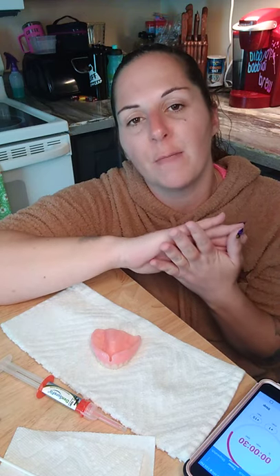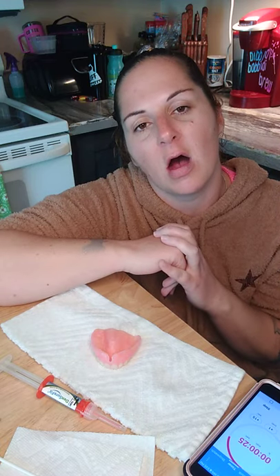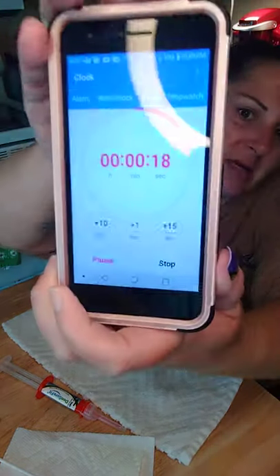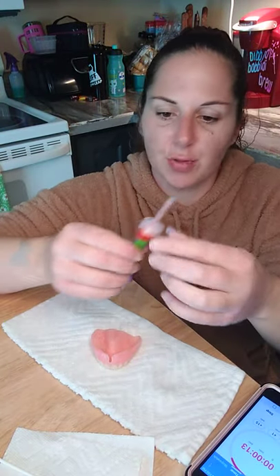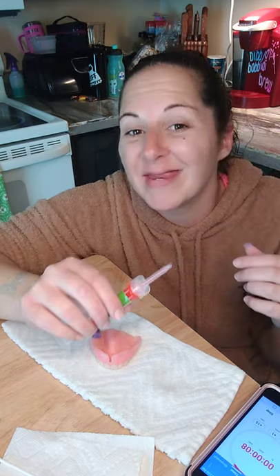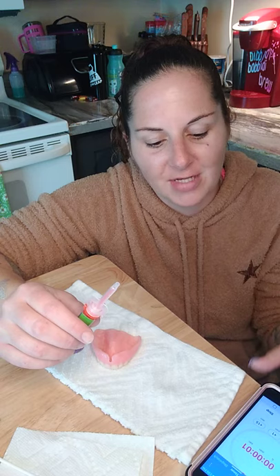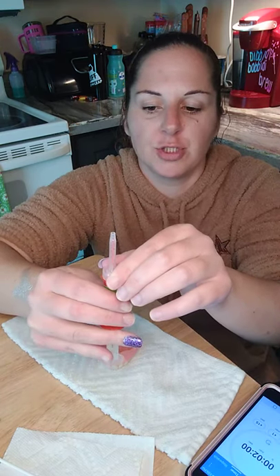Once 4 minutes are up, then you want to cut the extra stuff off like you would normally do with a soft reline. But get ready, guys, because we're going to start in about 17 seconds now. So when that's ready to go, I'm waiting. I'm waiting. It's soft silicone and it's awesome. And it's great for suction. And there's my alarm.